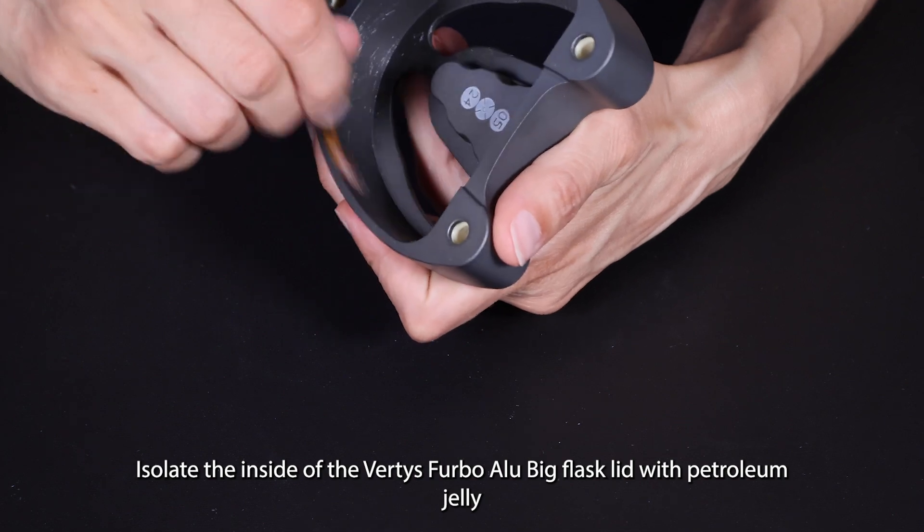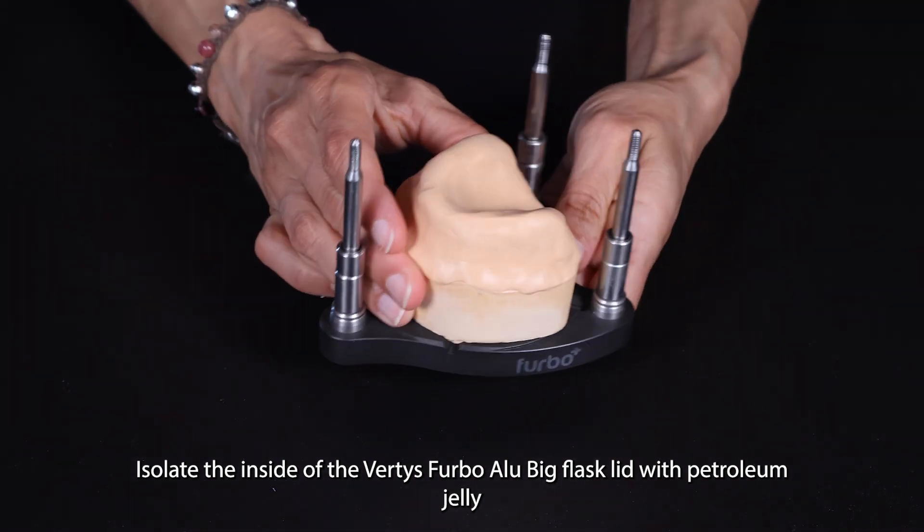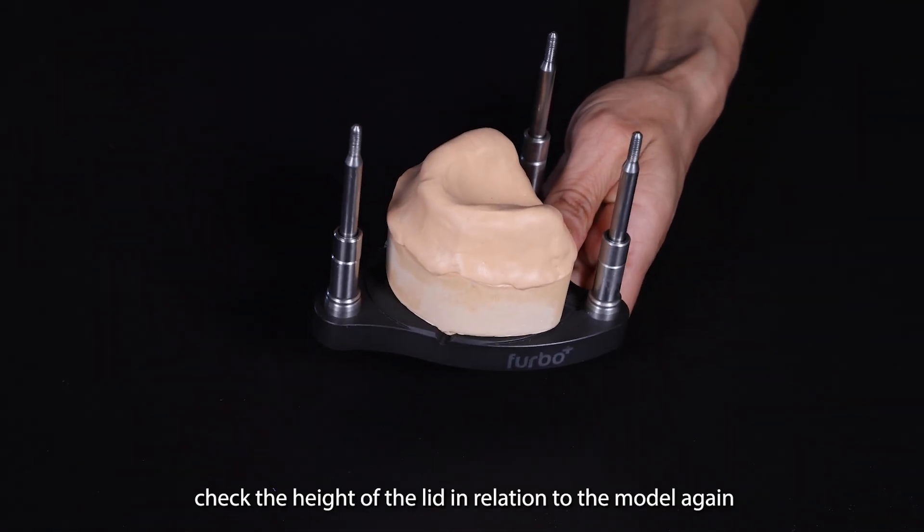Isolate the inside of the Vertys Furbo Alu Big flask lid with petroleum jelly and check the height of the lid in relation to the model again.